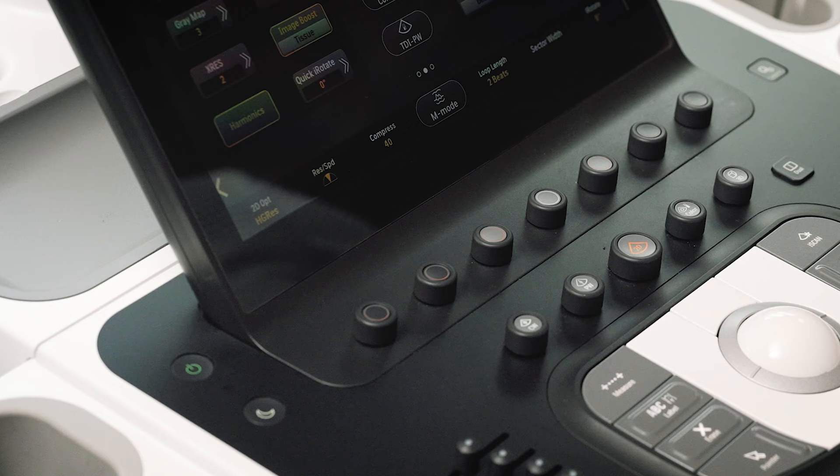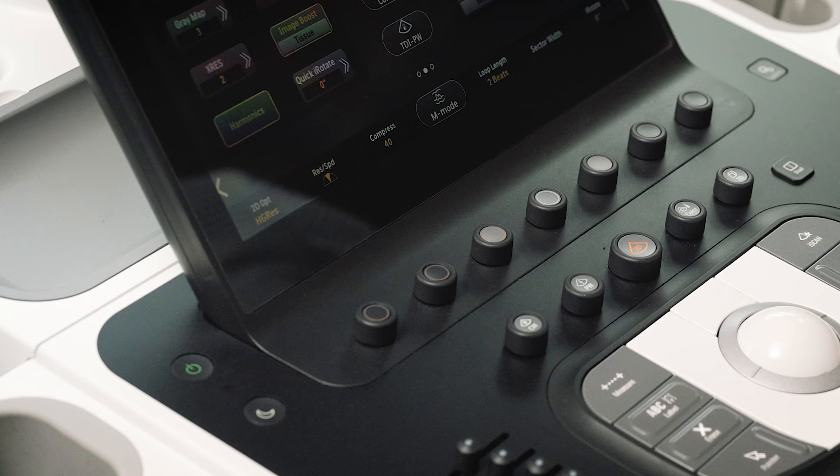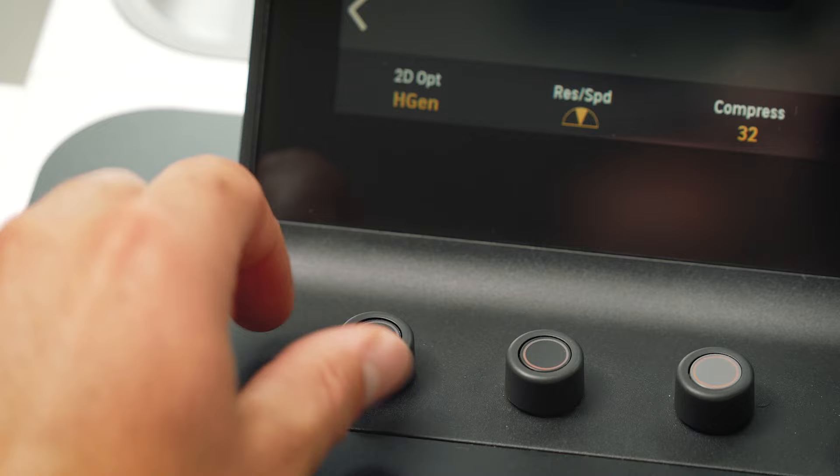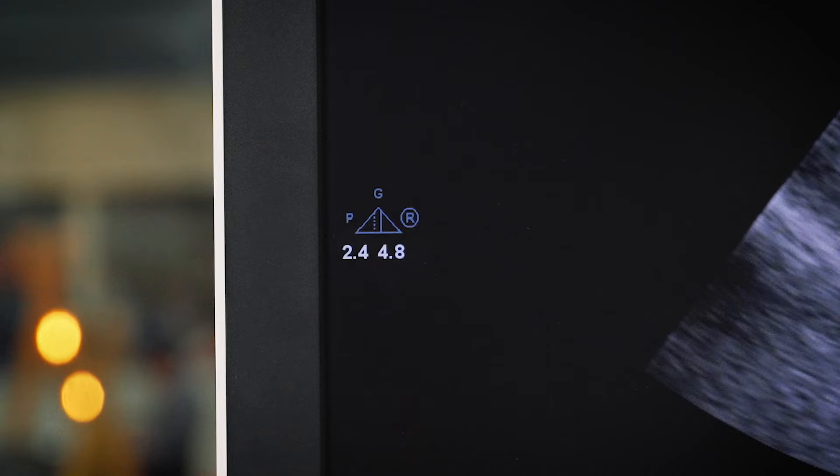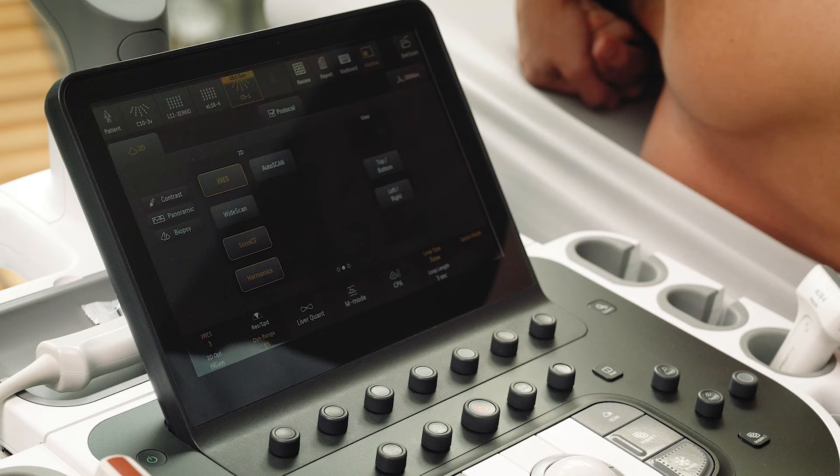2D optimization settings are found on the left of the touch screen. This optimizes the 2D scanning frequencies to allow for patient differences. There are five settings. Moving towards H-Res will optimize higher frequencies, and moving towards H-Pen will optimize lower frequencies.